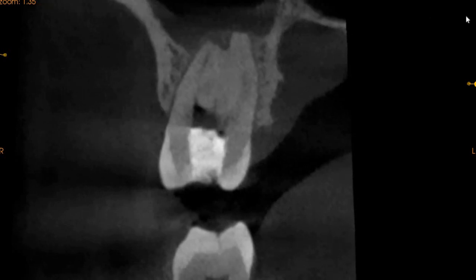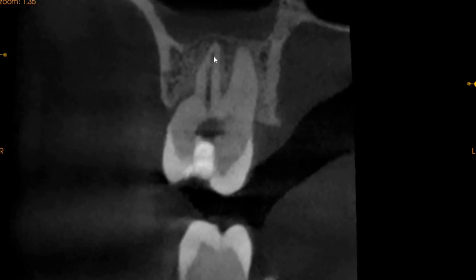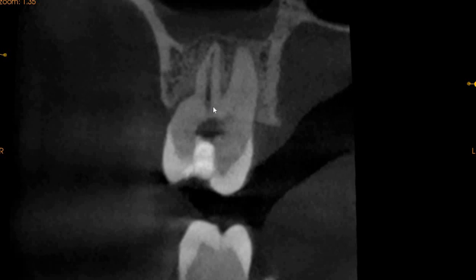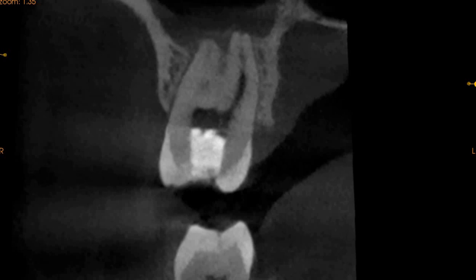Moving to the disto-buccal canal — the disto-buccal root is quite significantly short and narrow, so preparation of this root needs to be done very carefully. We can see it is prepared all the way to the apex. Minor sinusitis is present here as well, but no periapical radiolucencies can be seen.